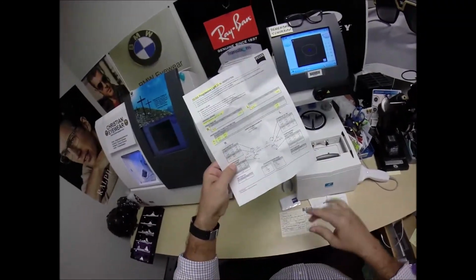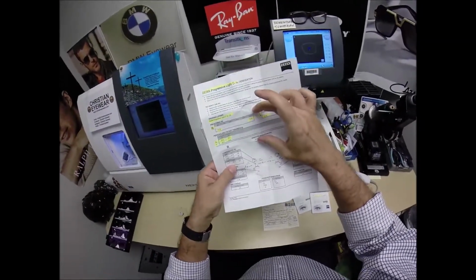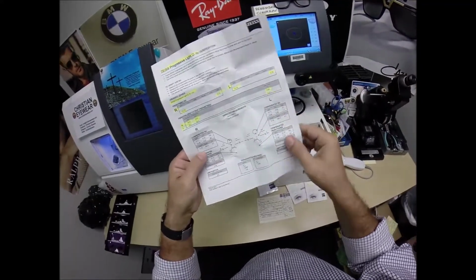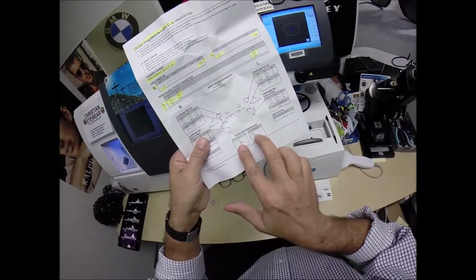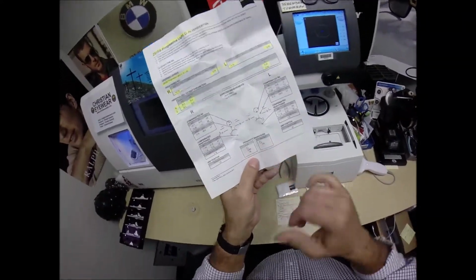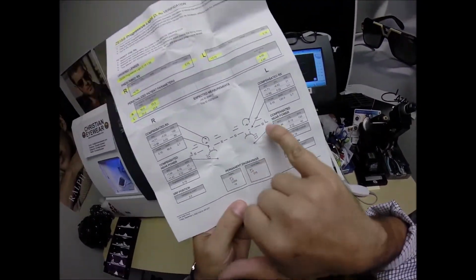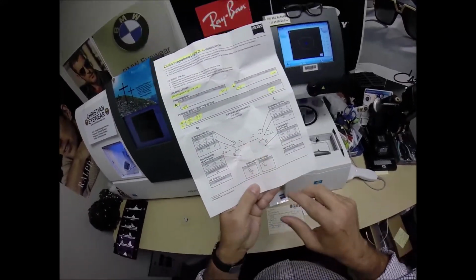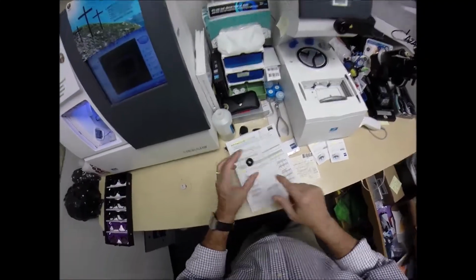But being digital lenses, it gives you the compensated formulas as it starts to go down. The top of the lens, your distance portion, as you go down, it gets stronger and stronger. It gives you all that data. The two dots that I had on the lenses correspond with the laser engravings that are down here. So if you go to your doctor's office, hand them that sheet, say, here's the engraving for the nasal portion. Here's the engraving for the temporal. Here's the layout chart. You put those two dots there for the right lens, 2 dots there for the left lens. Once it's turned over, then you get the optical center height, and that gives you all of that.